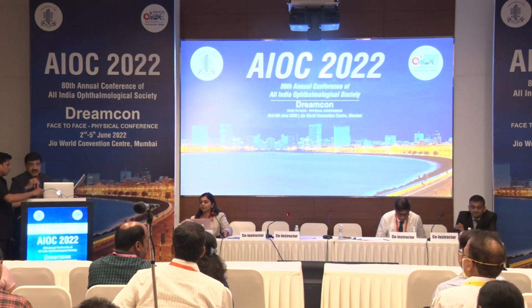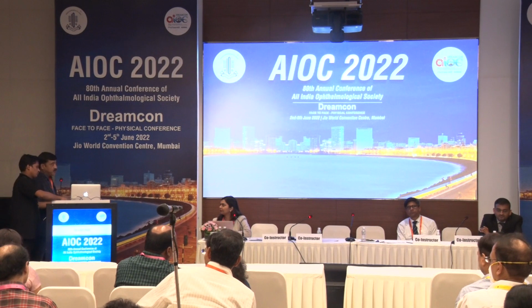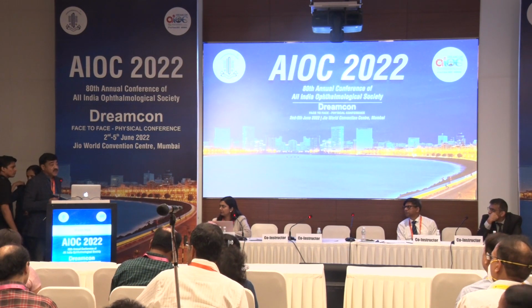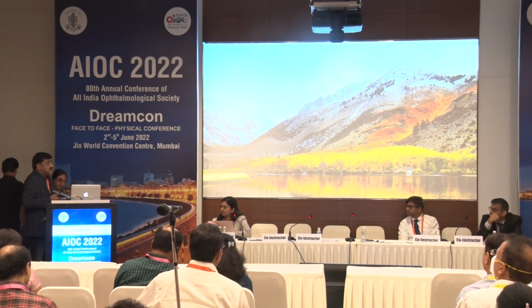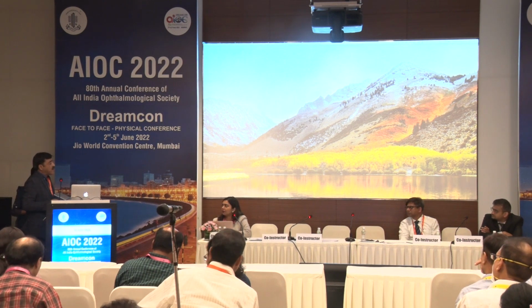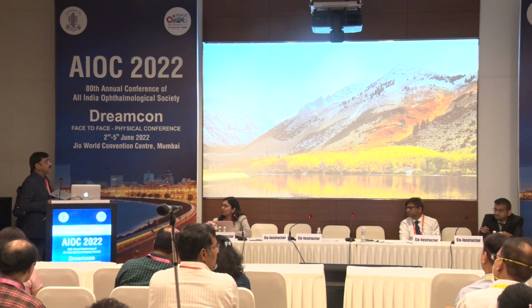See, for all patients who would not go for a toric IOL or not pay for it, when we go for either the EyeHance or EMV, anything above 0.5, I am going for arcuate keratotomy. Anybody above 0.75, I would advise the patient to go for toric IOLs. This is an extra tool that I would not have corrected normally, but since the patient is going for a femtocataract, even a normal monofocal lens, anything above 0.5 I correct with the arcuate keratotomy. Above 1 I definitely tell them, but I have done up to 1.5, when the patient could not afford it, or has gone in for EyeHance or EMV lenses.